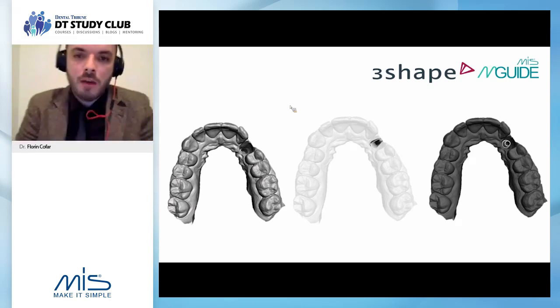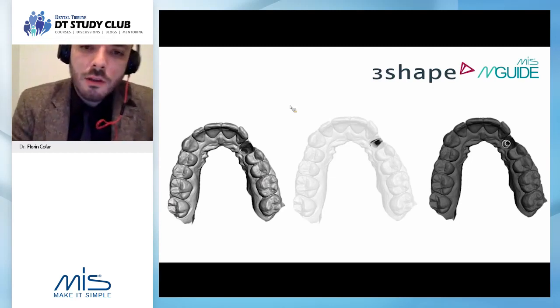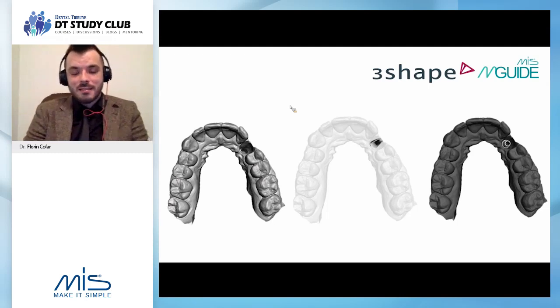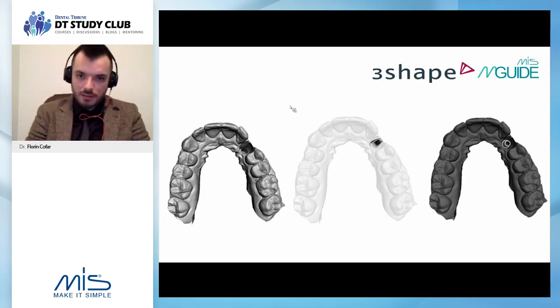And then I can either export a digital scan body from the implant planning software, or I can scan the position in the mouth, because even though the precision of the guide is very high, sometimes because of the index system of the implant, you can have a problem if you want to go at the same time with the abutment and with the crown at the time of the surgery.